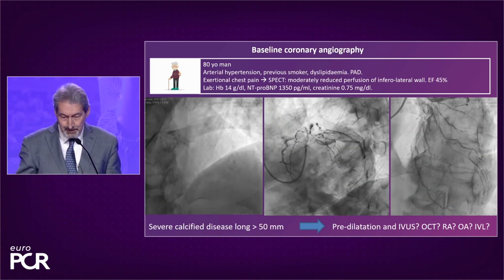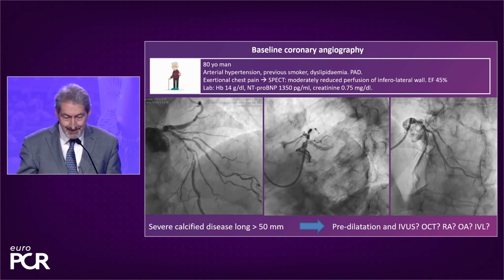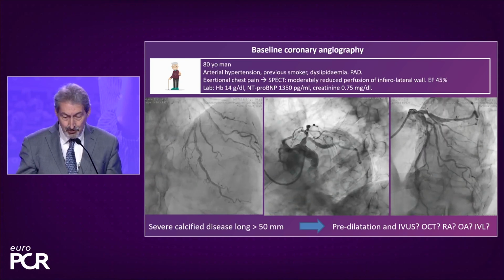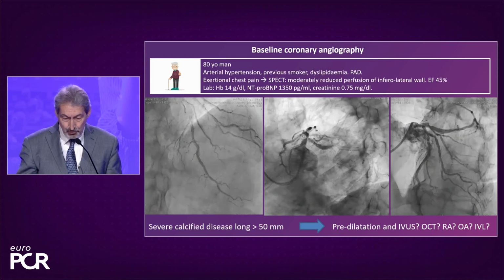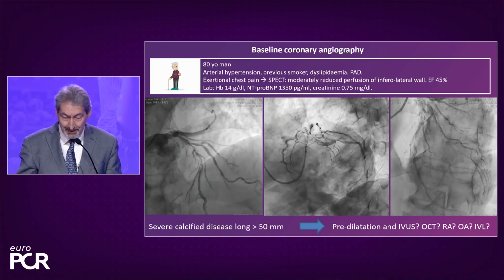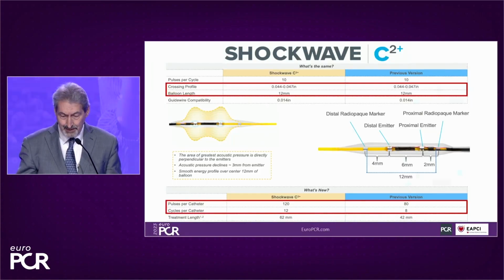And if you look at these 3 angiograms, you see a very long calcified segment, a double rail, especially at the level of this large diagonal branch in the proximal LAD, and beyond you have most of your calcium, but definitely there is involvement also of the left main. The circ is limited to a posterolateral branch, and there is occlusion of a marginal with a very large and not critically ill right coronary artery.